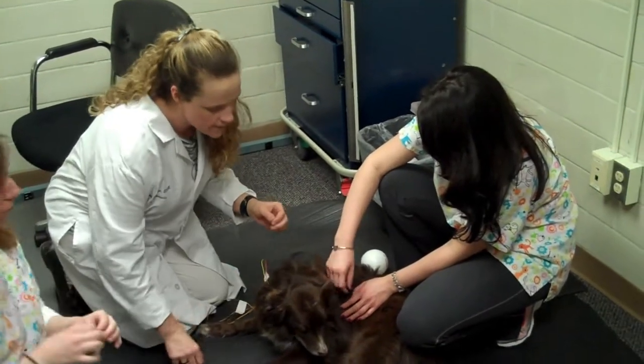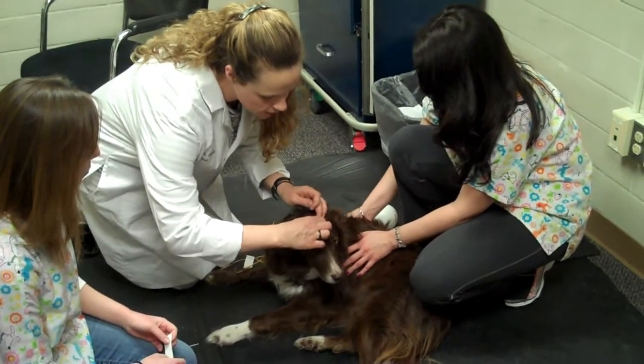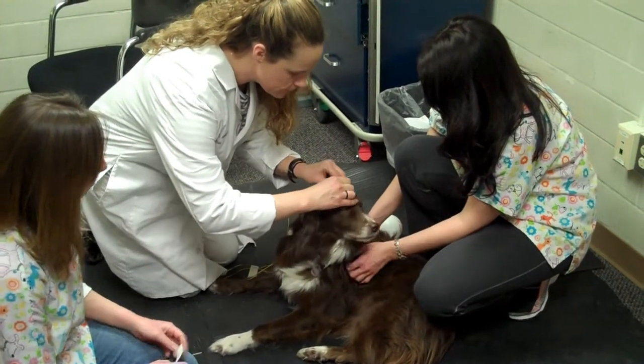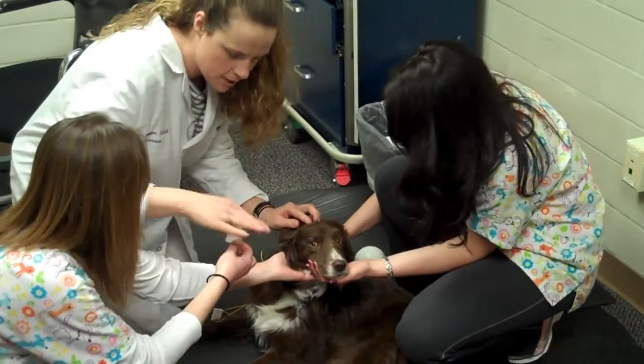Sometimes we'll periodically have to stop during the testing and just make sure that we're positioned properly. What we do is, on the three places where we put our cream so that they won't feel any pain, we just have to lift the skin a little bit and then place the first needle on top of her head.